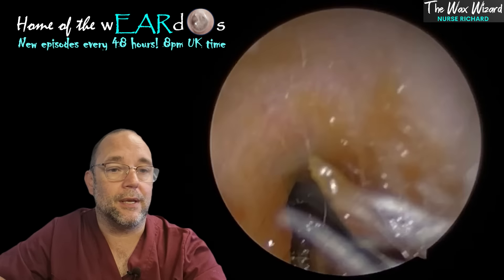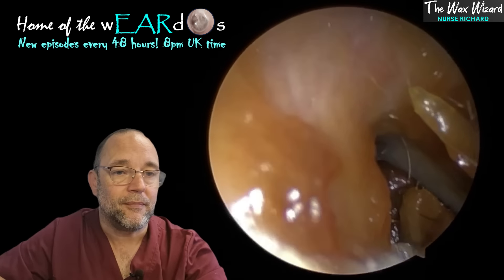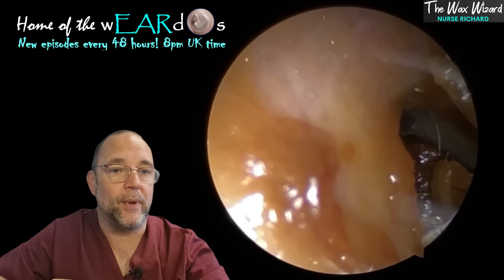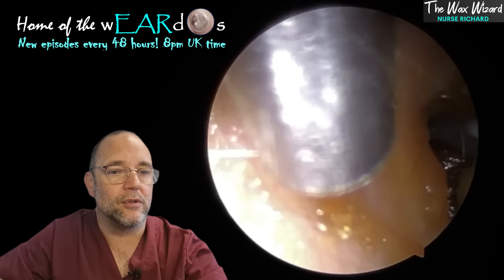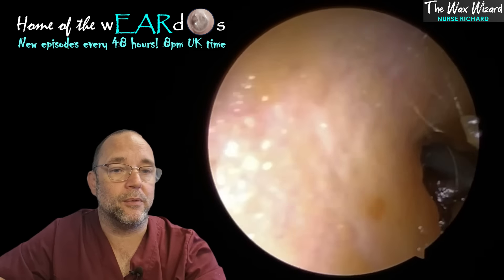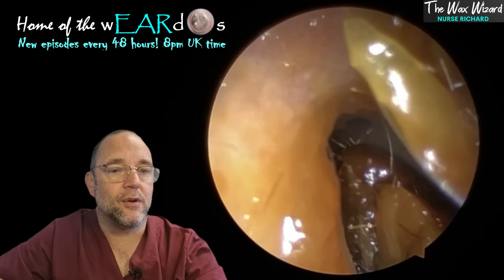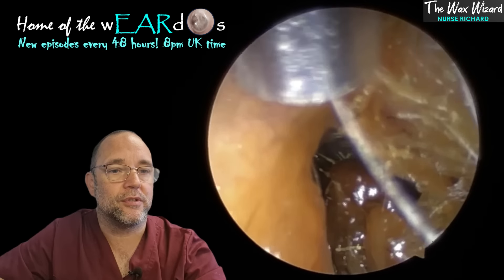After I remove this with the forceps, there is a little mark on the eardrum — and there you go, you can see the little mark there. That's probably where they put the grommet in. She doesn't think it was ever properly in place and thinks it fell out quite quickly. Even if it didn't stay in, it would have left that gap open for a bit, so it would have helped the problem somewhat — maybe not for as long as it should have done.